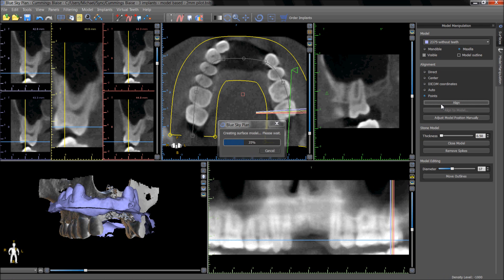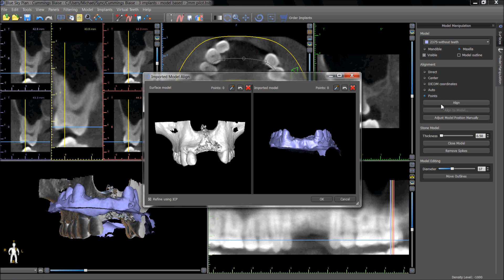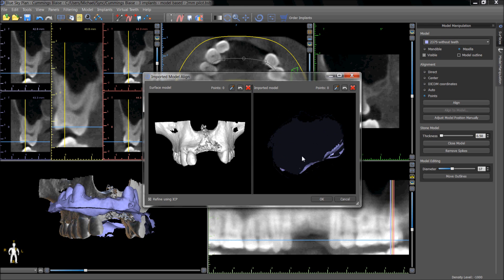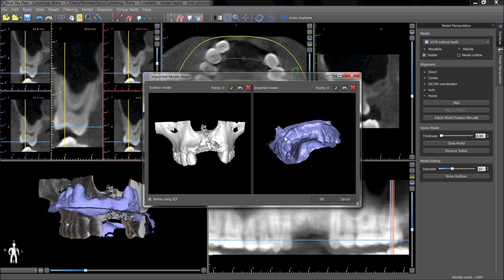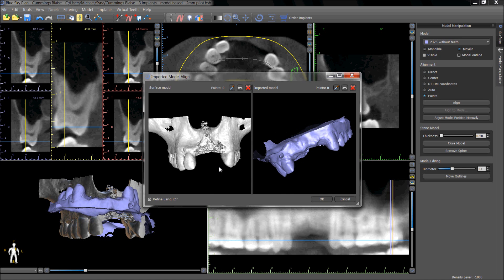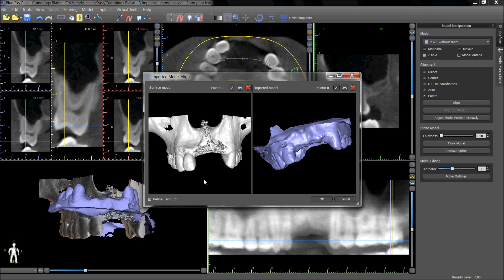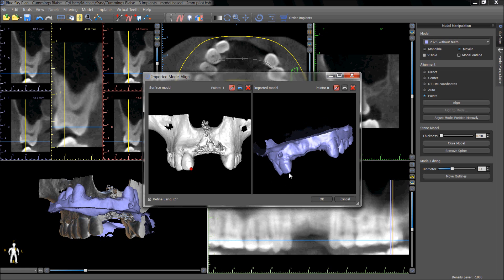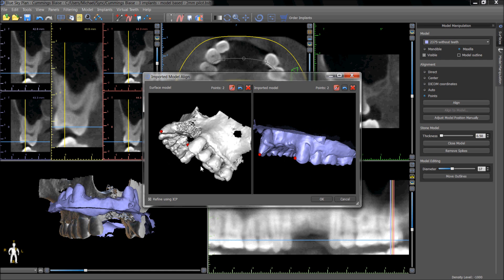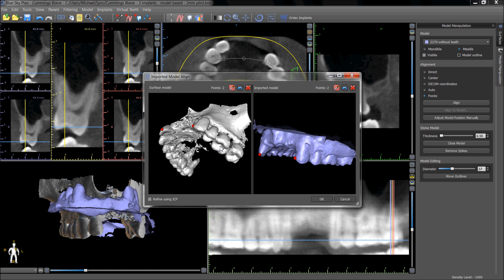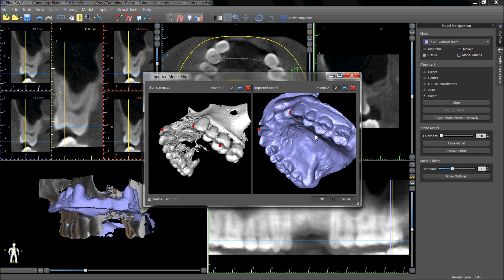Pressing the align button will open a window that shows simultaneously the model and the CT scan of the patient. Holding down the shift key and left clicking with your left mouse button will place a dot. Dots should be placed in clearly identifiable locations that are visible in both the CT scan and the optical scan of the patient. The points should be distributed throughout the scanned area — mesial, distal, buccal, and lingual.